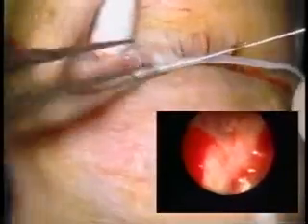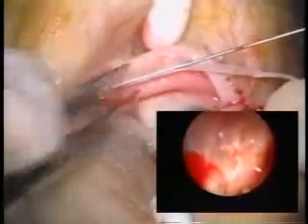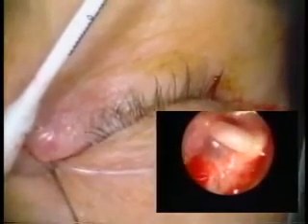The metal probe is removed and then the nunchuck tube is inserted. After making the tip portion of the tube flexible by drawing the metal probe 5 to 10 mm out of the tube, the nunchuck tube is introduced into the lacrimal sac.